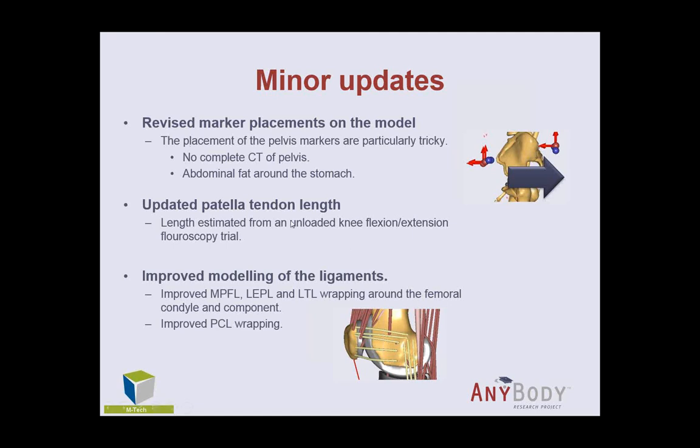In the beginning, we had also estimated the patella tendon length from the CT images, but as I will show in a bit, we actually segmented the fluoroscopy trials as well. So there we thought we had a better estimate of the length of the patella tendon from the fluoroscopy, so we used that one instead. So we estimated the length of the patella tendon from a fluoroscopy trial instead.